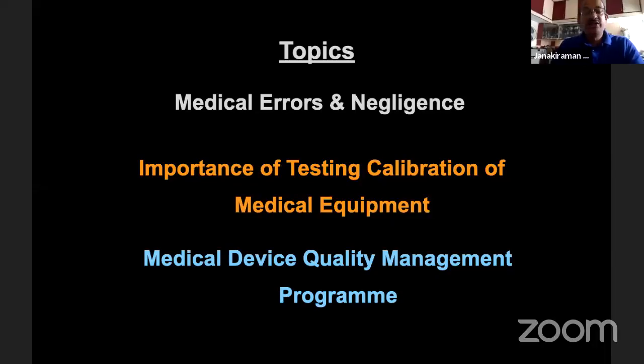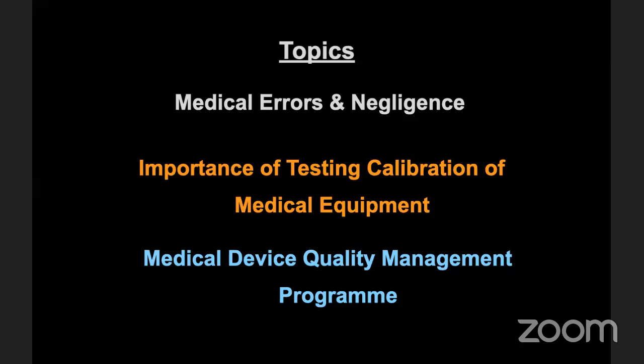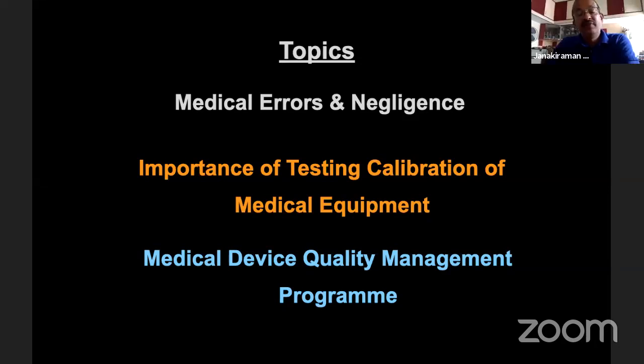There are several medical equipment in the industry, and these are categorized as critical and non-critical. For critical equipment, at what frequency should we test it, and for non-critical, what should be the frequency of testing? Usually these are available in the service manual. In the absence of the service manual, there is certain risk scoring involved through which we can establish the frequency of testing a medical device.